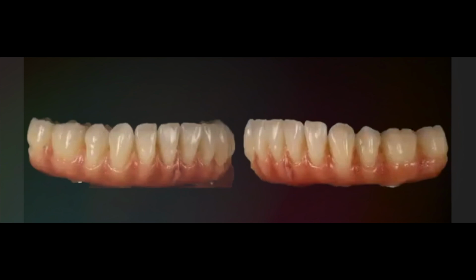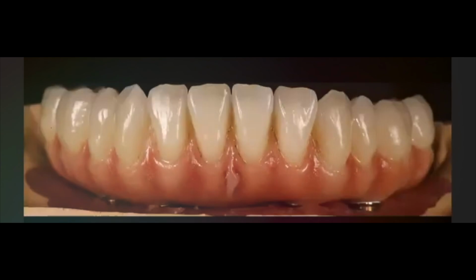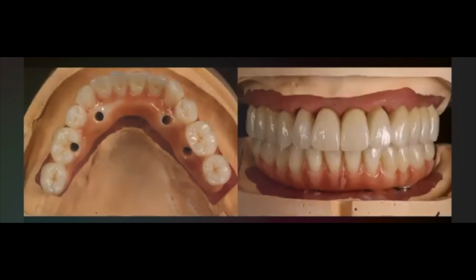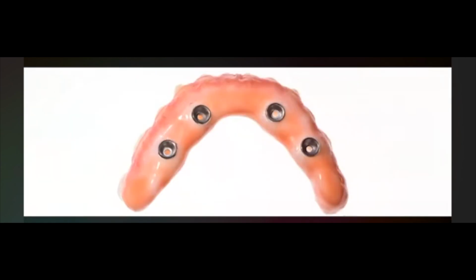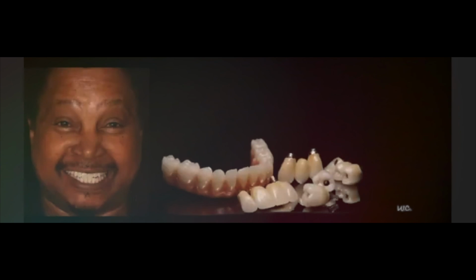And this is the final mandibular case. An occlusal view, and we cemented the titanium interfaces, the Ti base. We checked the function, protrusion, and canine protection. And this is the final restoration.